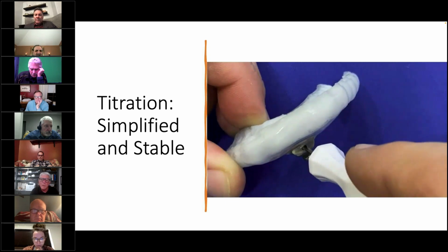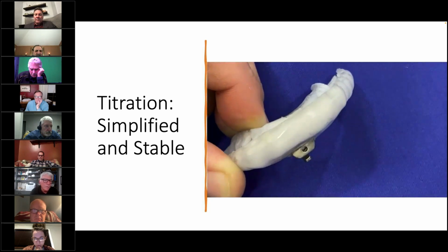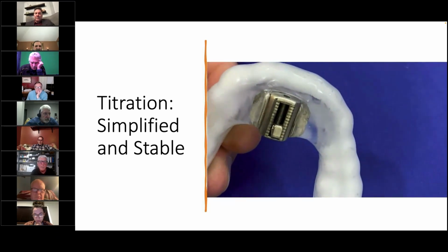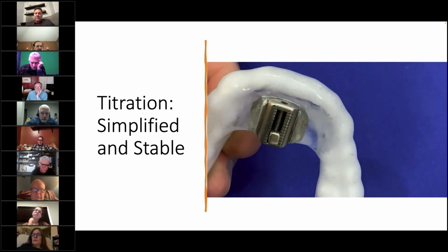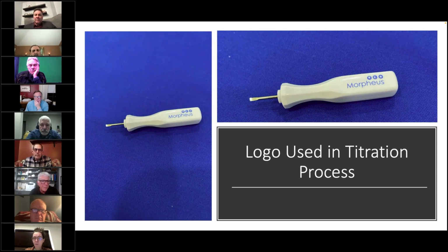So the key goes in place and it gets turned to the right to move forward. And you'll notice that there are 9 millimeters built into the original titration screw. In most cases, it will never have to be adjusted to get more titration. The logo is used in the titration process, so we can tell how far. If you turn that Morpheus and you put it in place and you turn it one half a turn, right? That's a quarter of a millimeter. Right? And then a full turn would therefore be a half a millimeter.